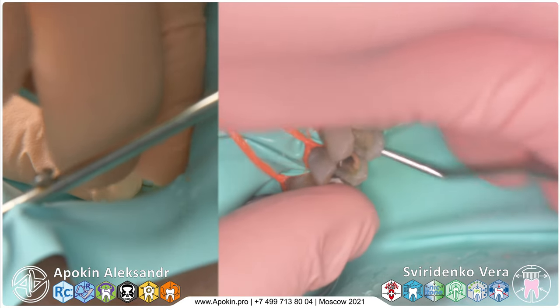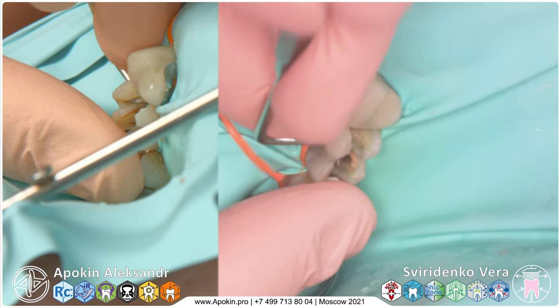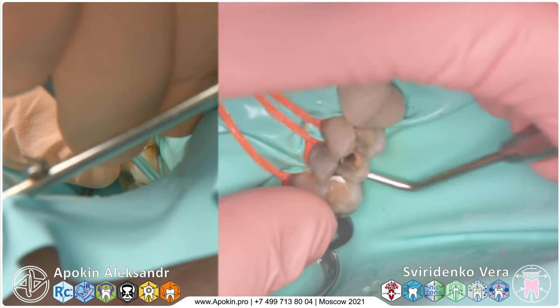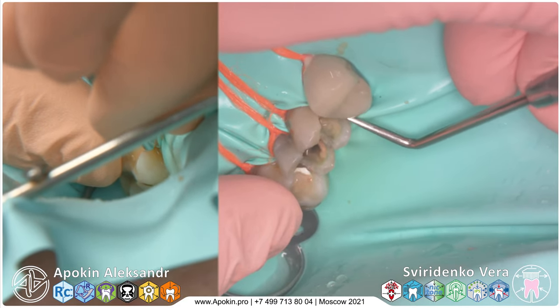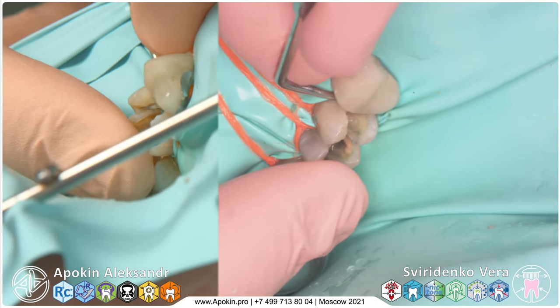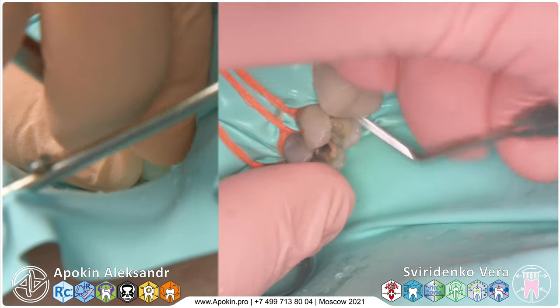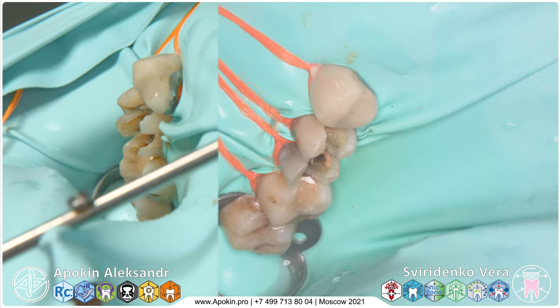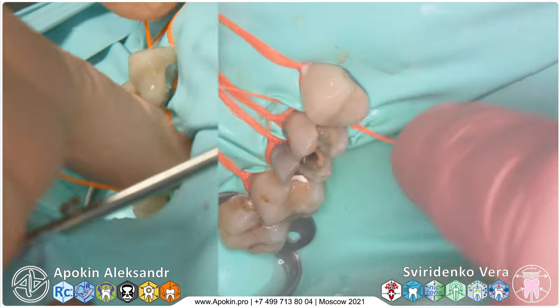This is not hard, just pay attention to this moment: sometimes, only in deep caries lesions of hard tissues, you need to check the position of the rubber dam in interdental spaces. If this is adequate, why should you be so close? And also you can check it with the floss.